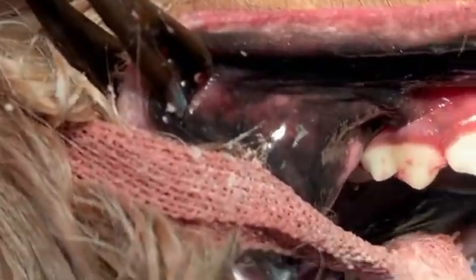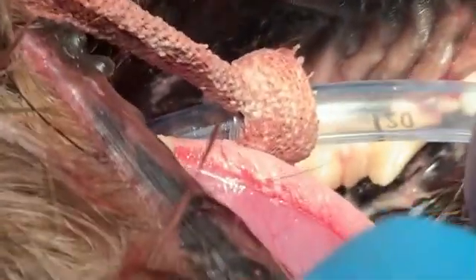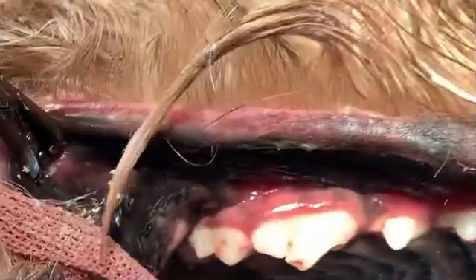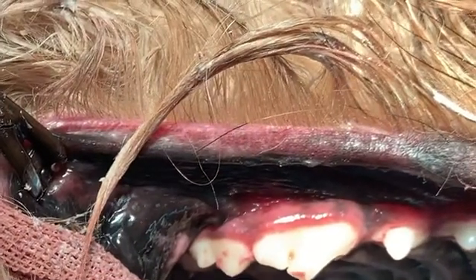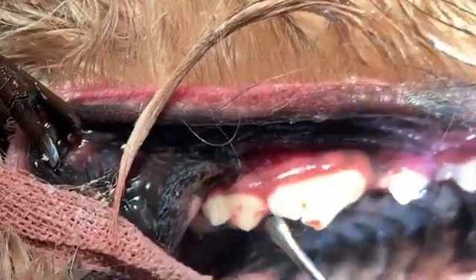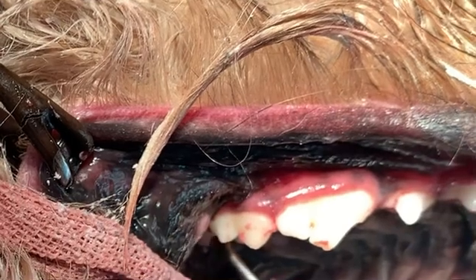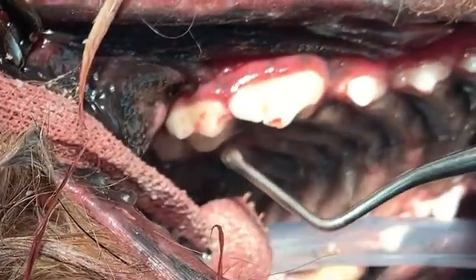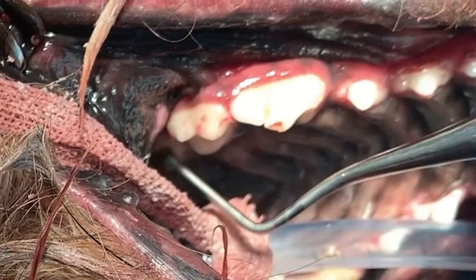Maddie, do you mind holding this for me? I'm going to get a little bit of exposure and show that here. See if I can adjust this in such a way that you can see. We're going for this tooth right here. It's hard to see because it's hidden behind that guy — that one way back there.